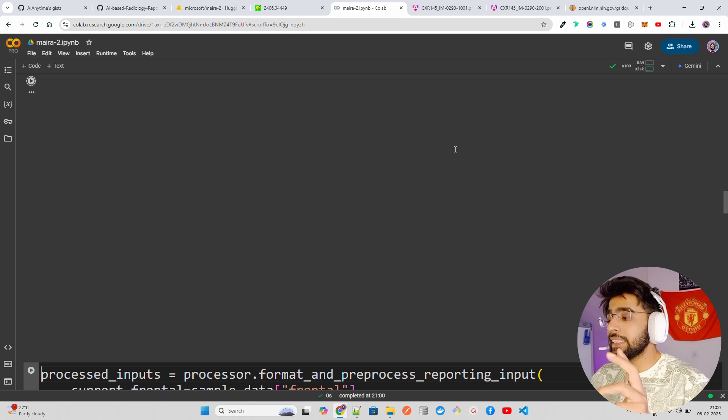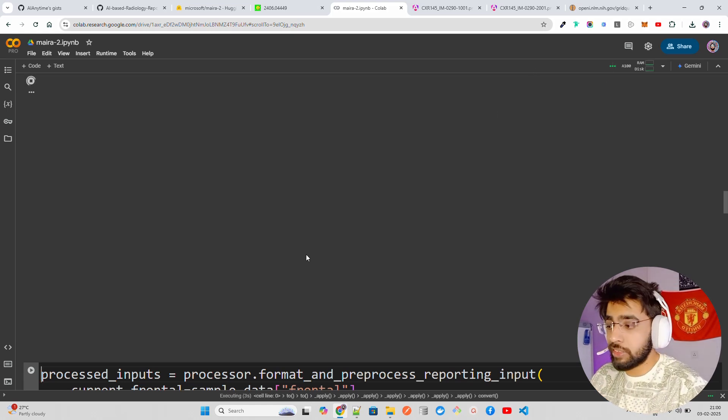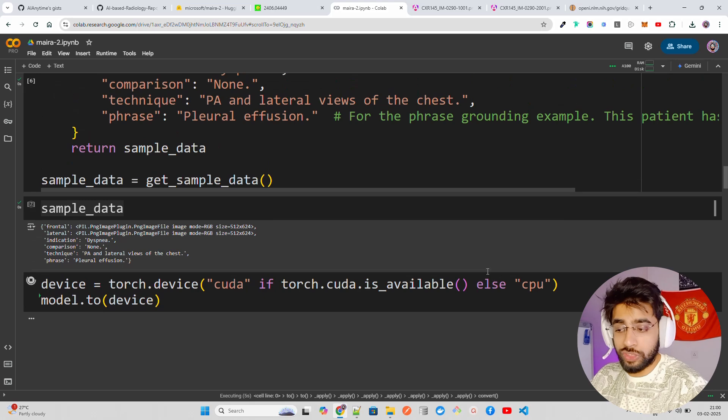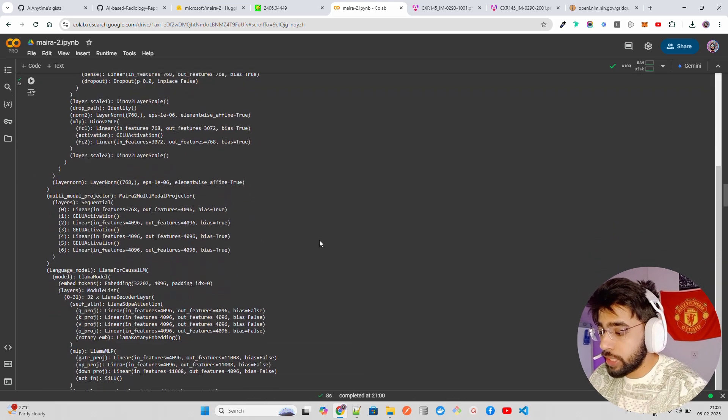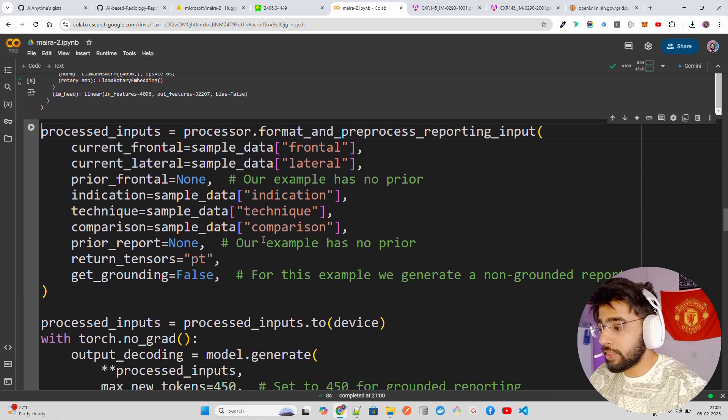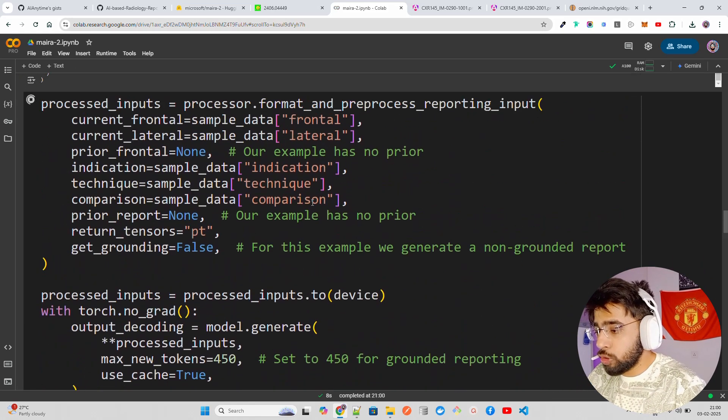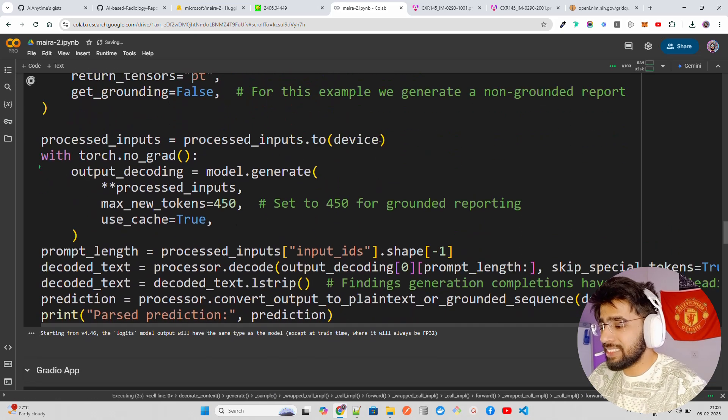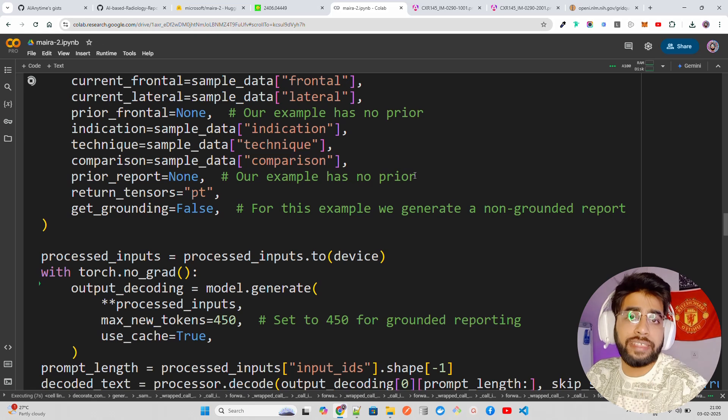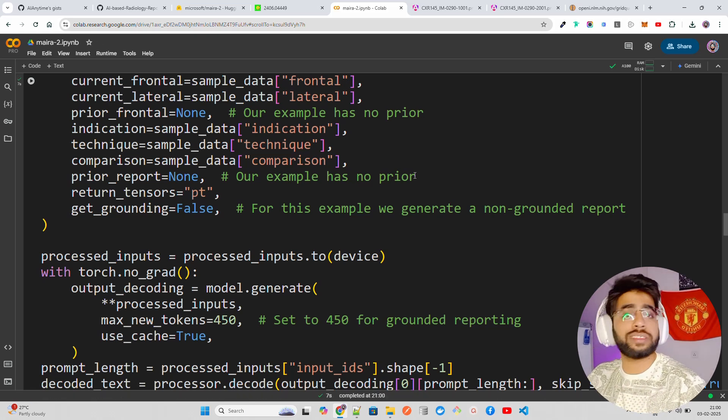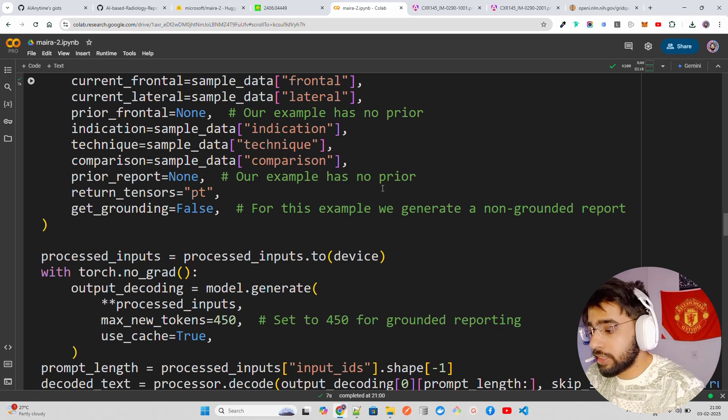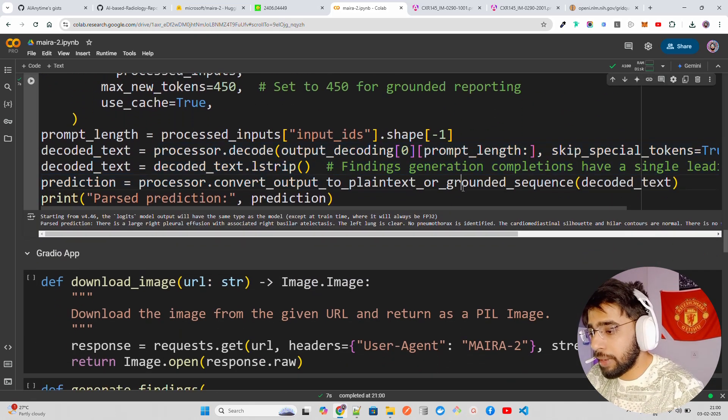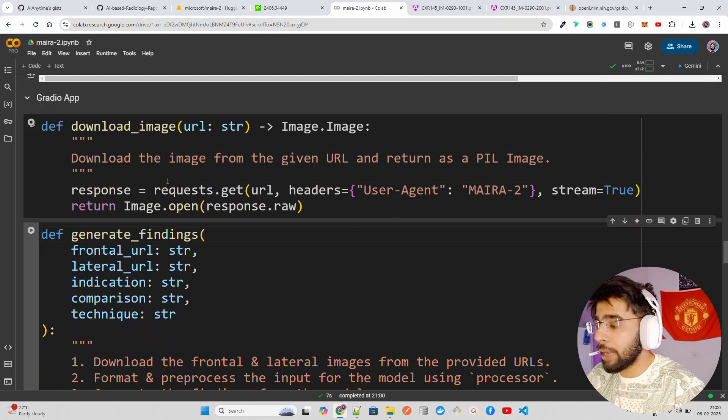What we are doing here, you can see it says get sample data. We are using openi.nlm.nih to get these images. If you print this sample data you can find out the frontal, lateral, all these details. Then we are binding this model on GPUs because we are using GPU so we can get faster results. It will not work on CPUs, by the way. This will crash, you need some sort of GPUs to use it.